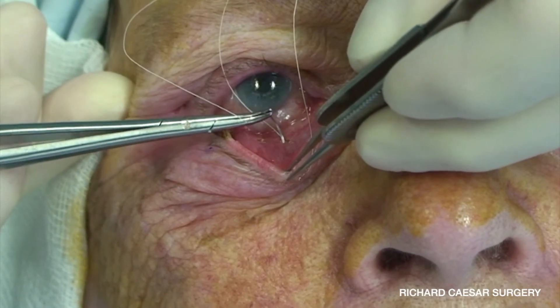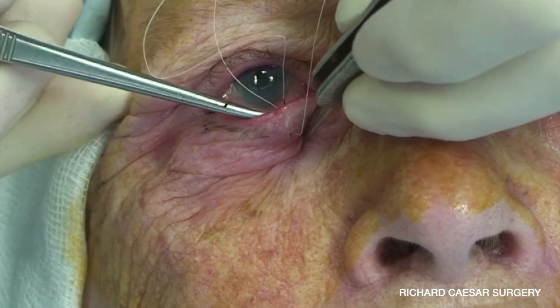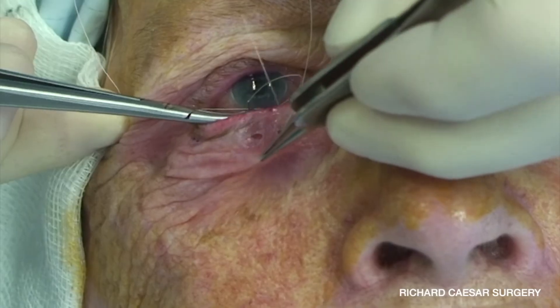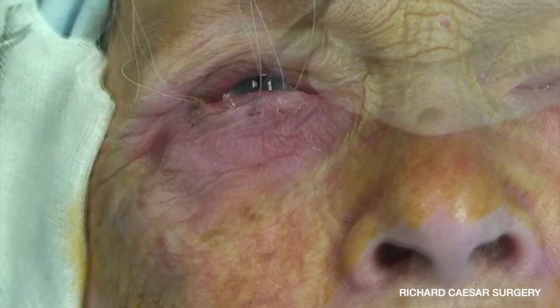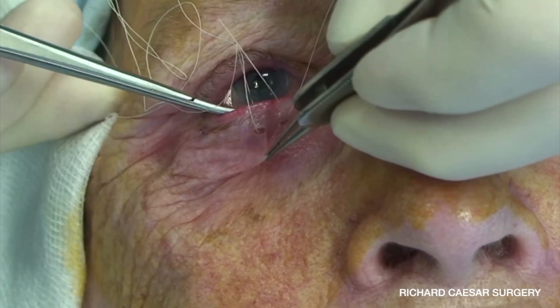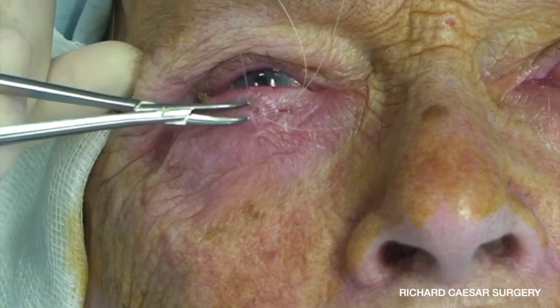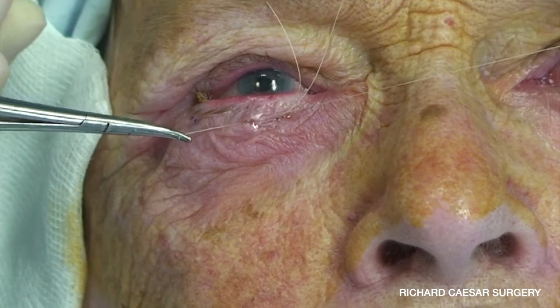The first arm is passed, then the second arm goes through a couple of millimeters laterally, and this suture is then simply locked with each end buried due to the nature of the stab incision. By placing the entry point at the level of the lower lid retractors and placing the exit point subtarsally using a 5-0 vicryl, you'll get a lovely eversion to prevent the entropion recurring.